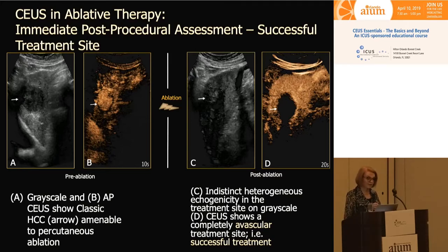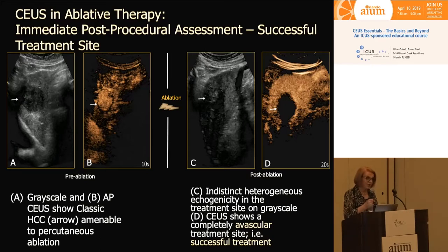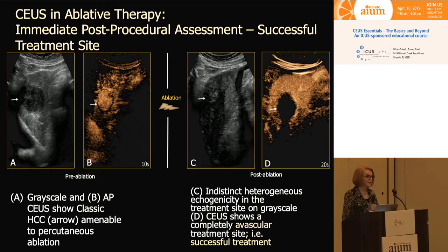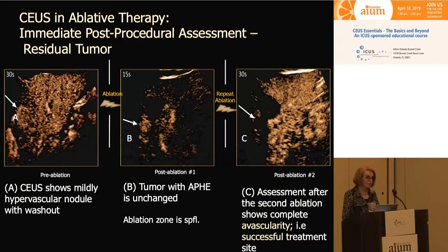When we consider contrast-enhanced ultrasound in ablative therapy, it's a very valuable technique. On the left side, we're looking at a grayscale and CEUS image of a liver tumor — it's hyper-enhancing. Then the ablation is performed, and on the immediate post-procedural follow-up scan we can see that the nodule is now completely avascular, suggesting successful treatment. This is very commonly done in my own department.